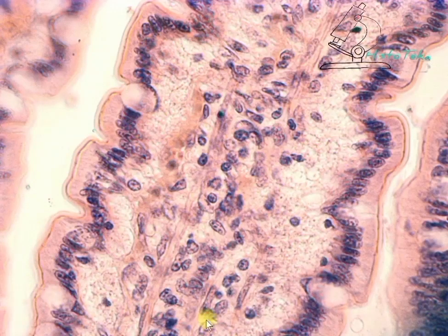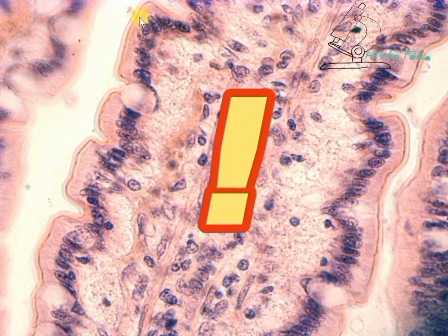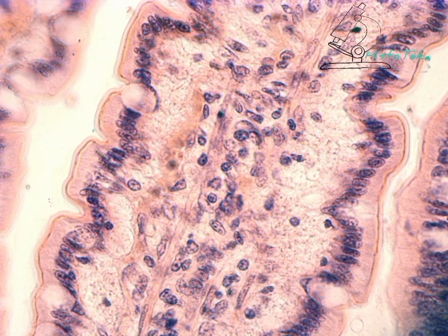A fragment of a villus at high magnification, a fragment of a neighboring villus, and another one, the lumen between the villi, and here, the stroma of the villus of loose connective tissue with blood vessels and smooth myocytes. The epithelium covers the villi from the outside. It means it goes along the edge of the villi, framing it. Simple columnar absorptive epithelium. What does it mean?